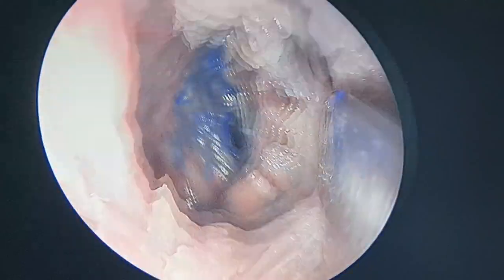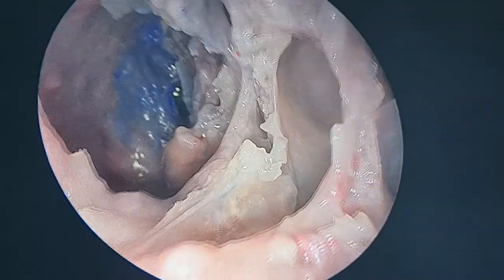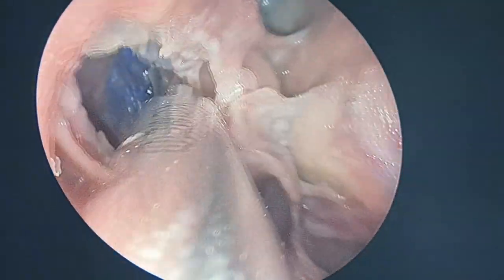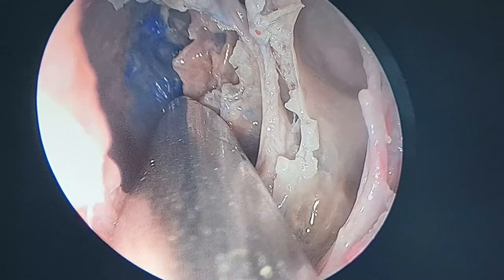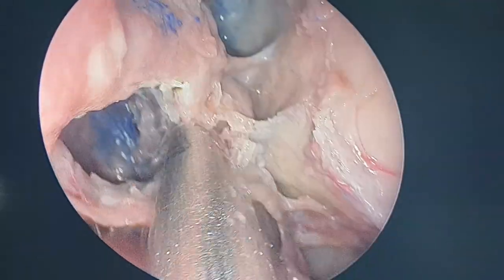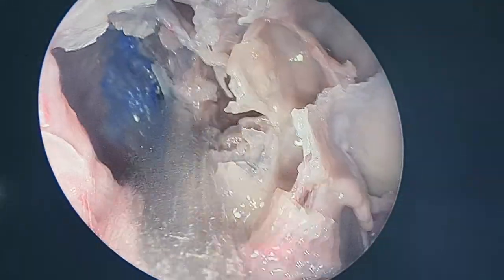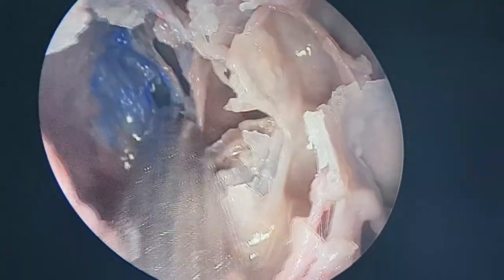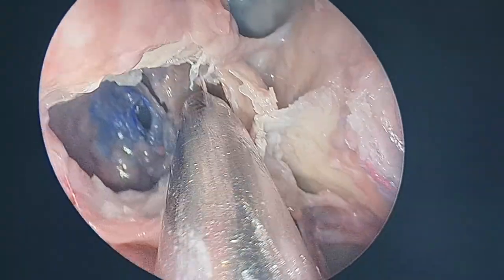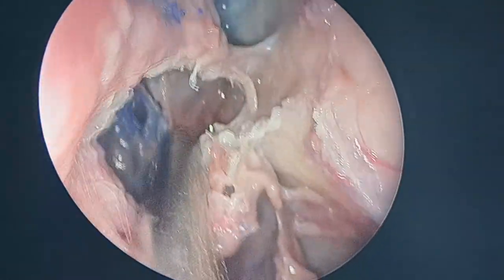ostium. Now why do I open the sphenoid ostium first, before doing the posterior ethmoidectomy? Because I have a fear of injuring the structures behind in the sphenoid sinus. Now, keeping this sphenoid ostium in view, I can dissect everything. Dissect everything without any fear. As long as I am anterior to the ostium, I cannot hit any carotid or optic. See now, you can do anything in the sinuses in your corridor.